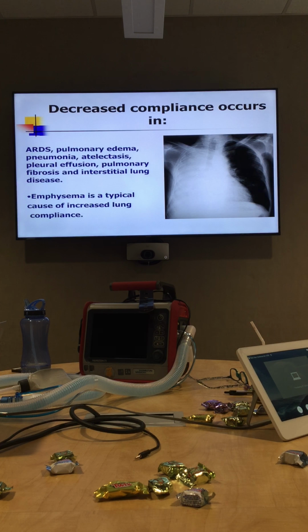And the reason I think we put 6 mL per kilogram in there is because of ARDSNet, treating ARDS and acute lung injury, and the pediatric guidelines that are now developed for treating acute lung injury and ARDS.